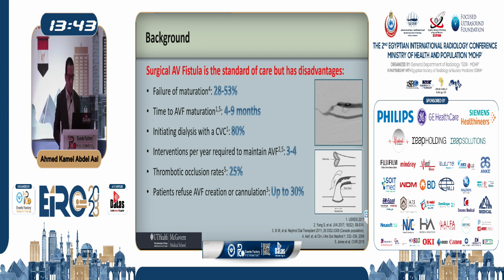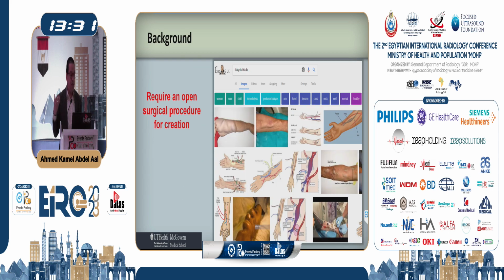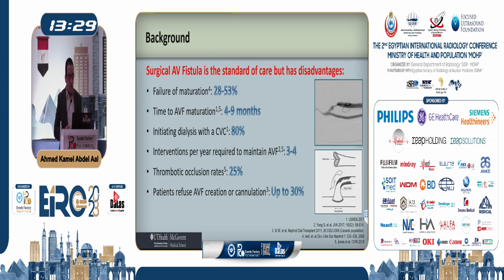And even 30% of the patients in America actually refuse to do that because they get appointment fatigue. They keep going back and forth between a surgeon, an interventional radiologist, they do Doppler and come back again and so forth, so they get tired. The reason these things happen with surgical fistula is that it creates an end-to-side anastomosis, as you can see here. With this, there is a lot of shear stress because of the torsion of the vein, as well as the junction itself creating a lot of shear forces, which leads to neointimal hyperplasia.